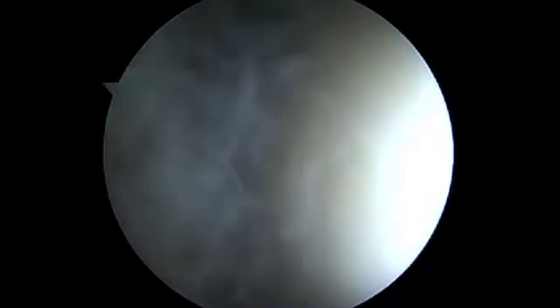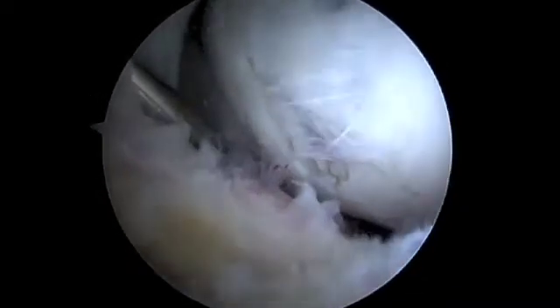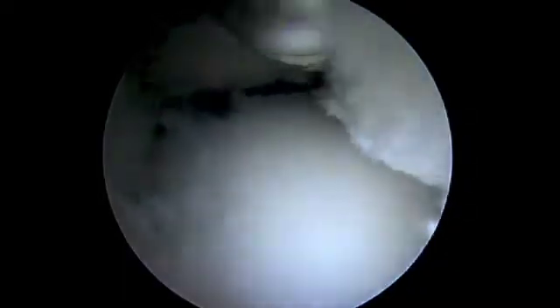Once central compartment arthroscopy is completed, the traction is let off the extremity and the CAM lesion is identified. With the leg in extension and internal rotation, the head-neck junction is identified and marked out with electrocautery. I like to use electrocautery to remove all of the soft tissue overlying the CAM lesion, as I find the burr to have improved tactile feedback during the osteochondroplasty with the soft tissue removed.